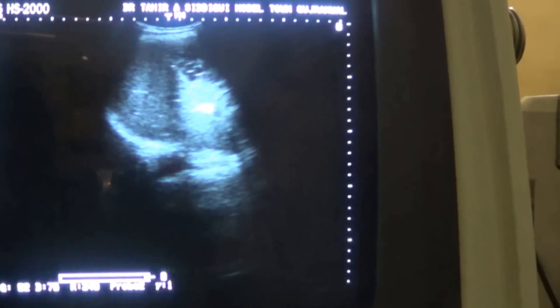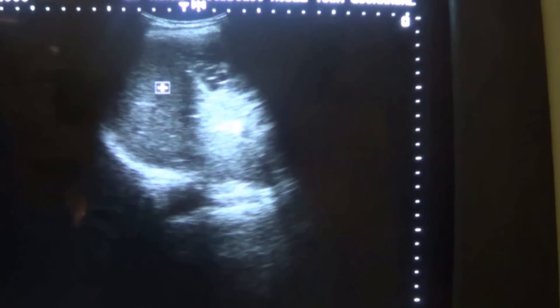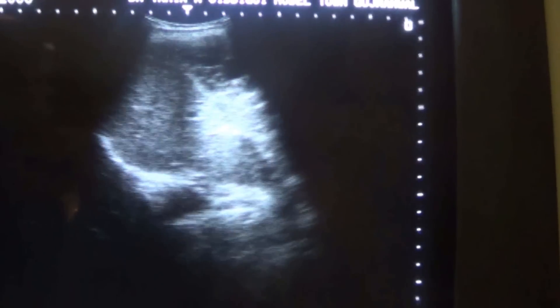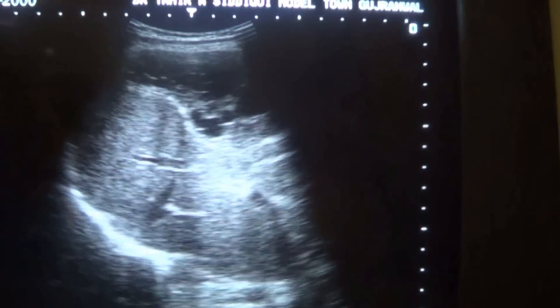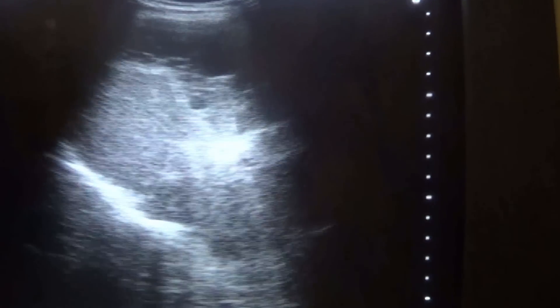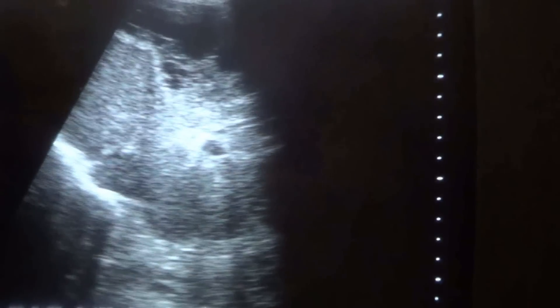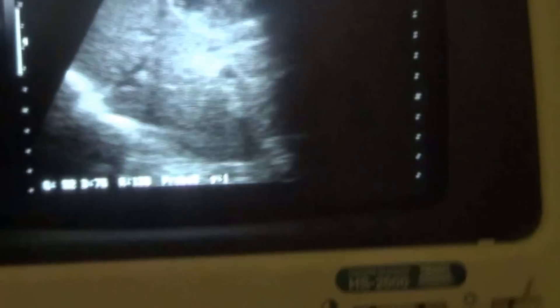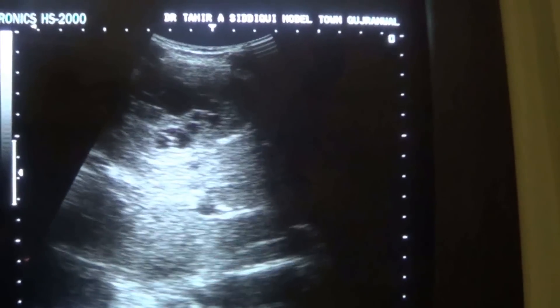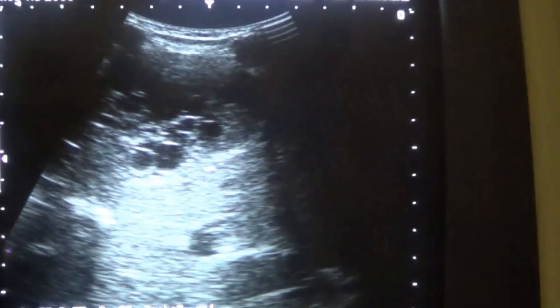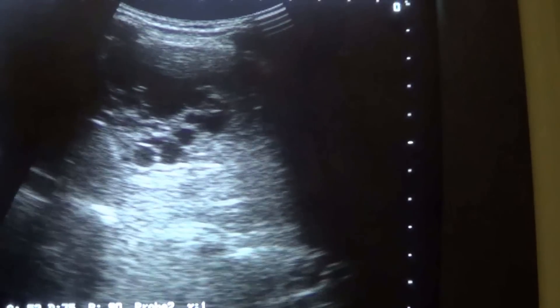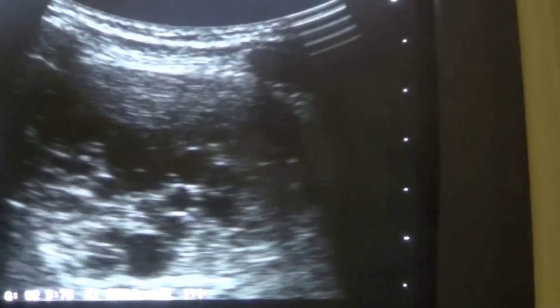Now, this is the right diaphragm and this is the liver — normal. In the liver, in the anterior segment, you see a cystic area, a multi-cystic area rather, well demarcated. This is the pathology.